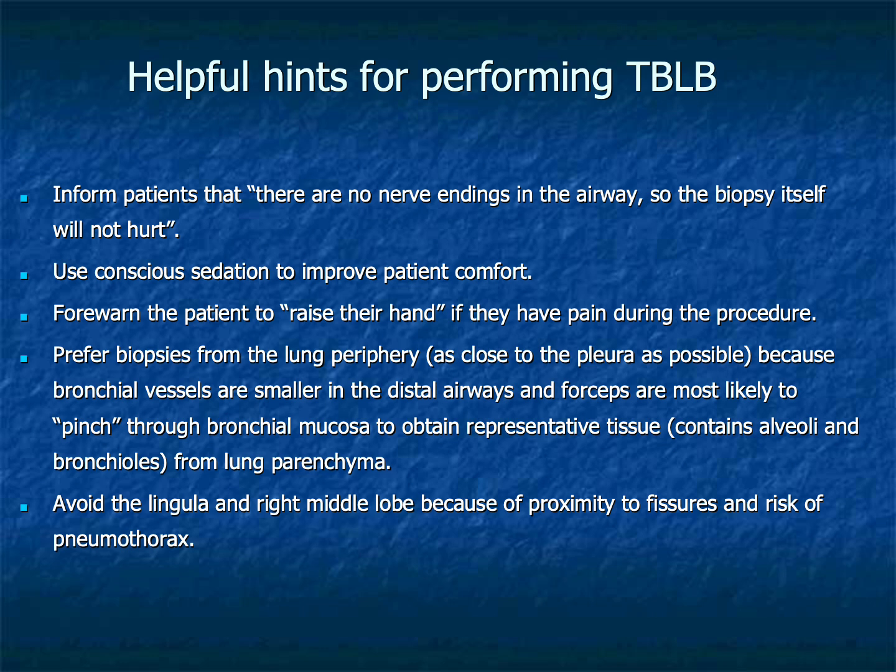The lingula and right middle lobe are often avoided because of their proximity to fissures, potentially increasing pneumothorax risk. Maintaining fluoroscopy time as short as possible, coordinating forceps movement with respiration, and preserving wedge position during forceps withdrawal all contribute to smoother, safer procedures.